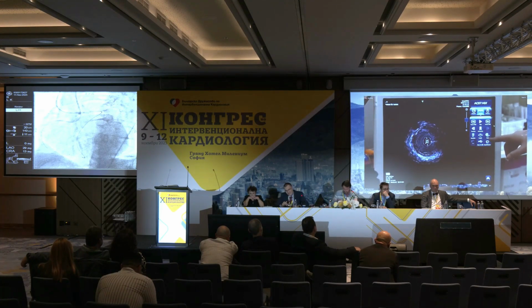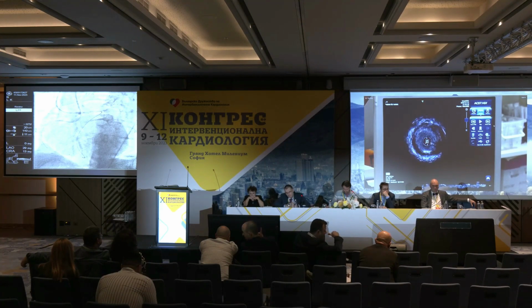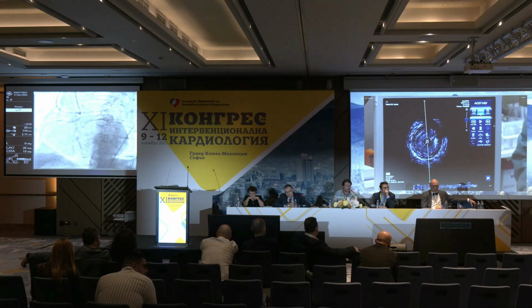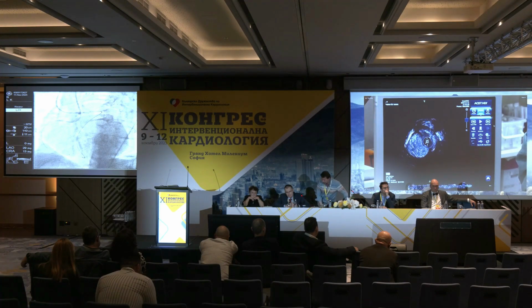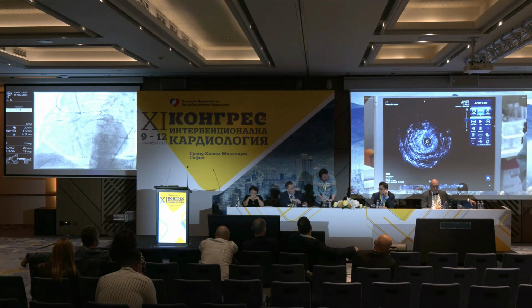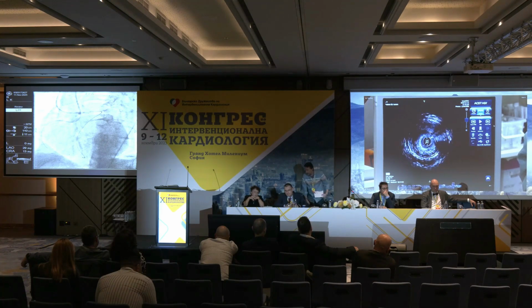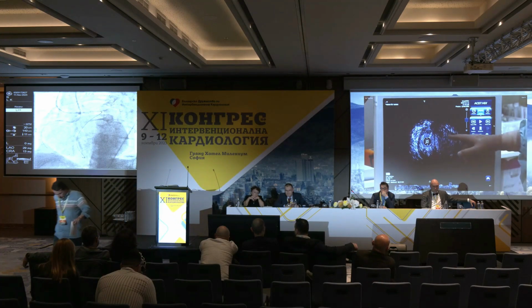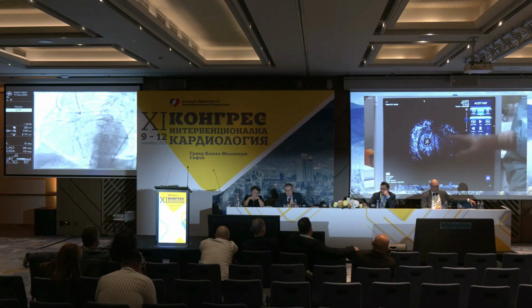You see that it is diseased over there, a little bit more proximal. There we start at the distal cap. Let's go more proximal. We are all intimal, no doubt. More proximal, it's all intimal. Clearly, and I will show you now, there is calcification at that point. I think we're still intimal. Stop here, please. You clearly see the external elastic membrane here. We are intimal.